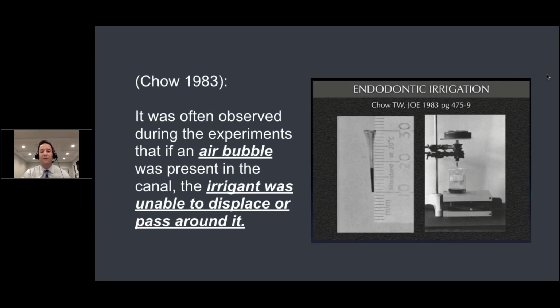So again, part of the result of this study by Chow was to show that there is an issue with bubbling, and that if air bubbles get into the canal, which, as I'll discuss, is a natural thing to happen when sodium hypochlorite reaches organic tissue, it is very difficult for further solutions to get past that bubbling.